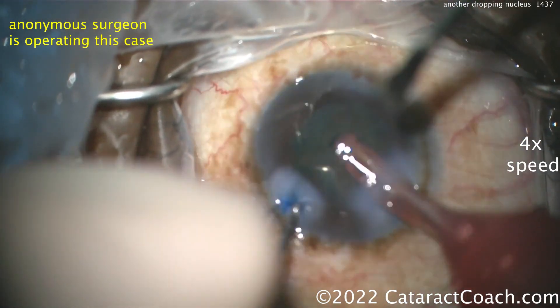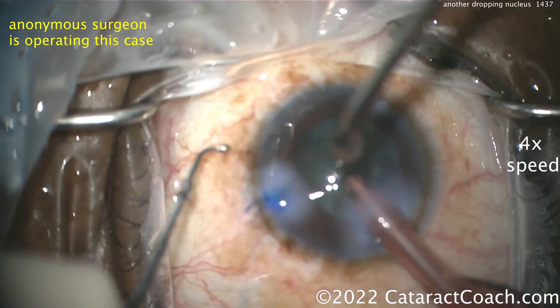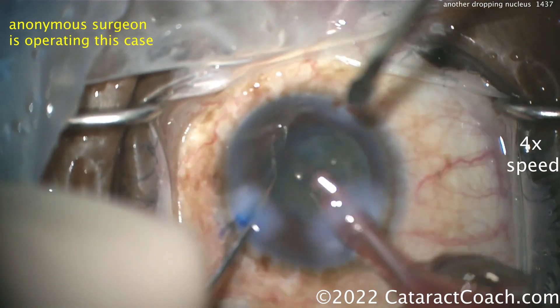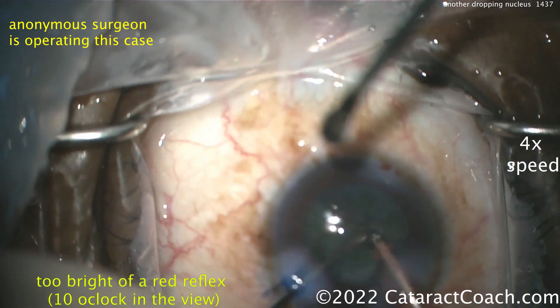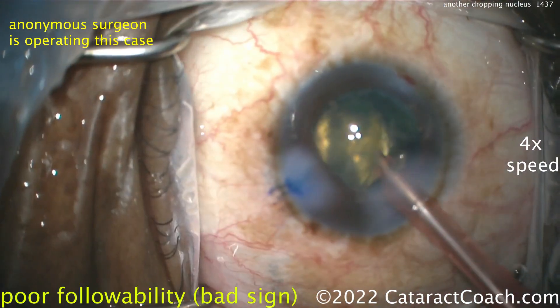If you can't rotate the remaining nuclear piece, my advice would be to get it out of the bag. Look at the corneal incisions — look how much edema there is in the cornea. That tells you how much leakage there's been from the incisions and how long you've been inside. Look at that bright red reflex — that means there's no capsule in that quadrant, no cortex, no capsule, nothing.